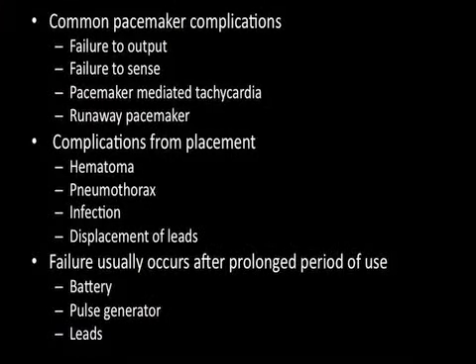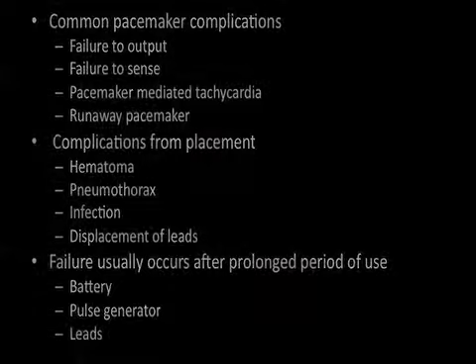Common pacemaker complications include failure to output or failure to deliver an electrical impulse, failure to sense or failure to sense the actual heart electrical conduction. Other issues include pacemaker-mediated tachycardia and runaway pacemaker. Complications from placement of the actual device include hematoma at the site of incision, pneumothorax, infection, and displacement of leads. Failure of the device usually occurs after a prolonged period of use. Parts that can fail include the battery, pulse generator, or leads.